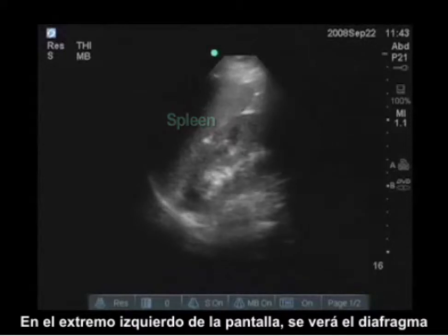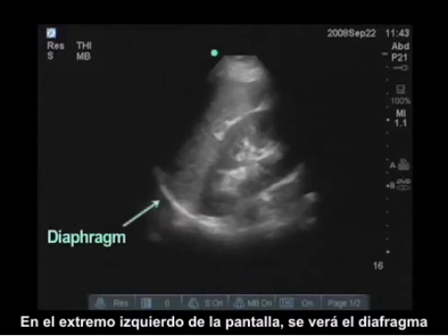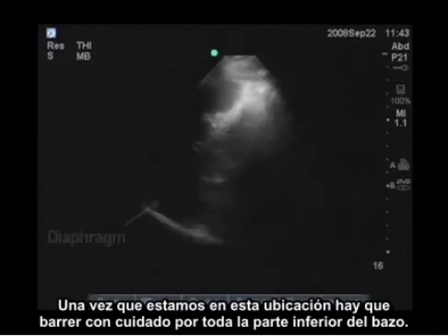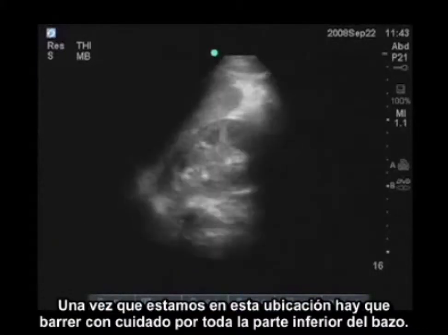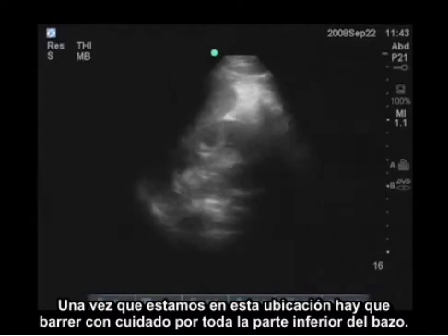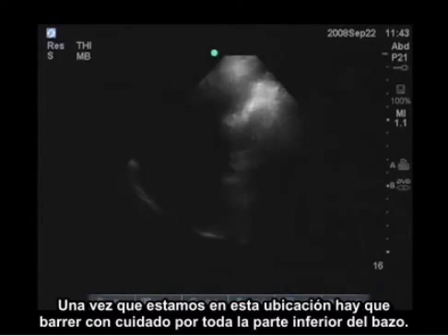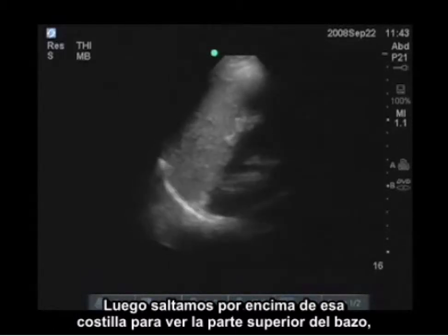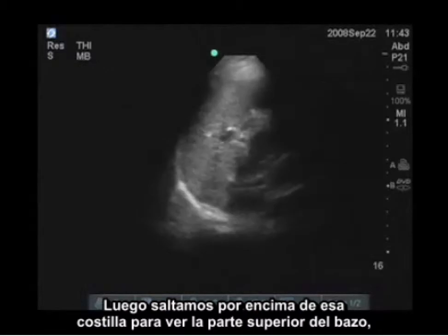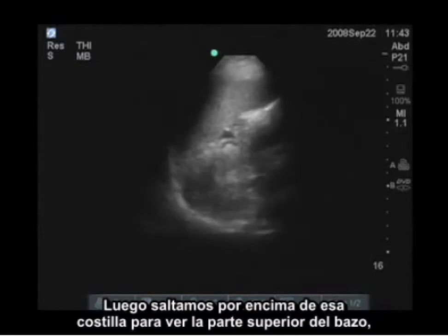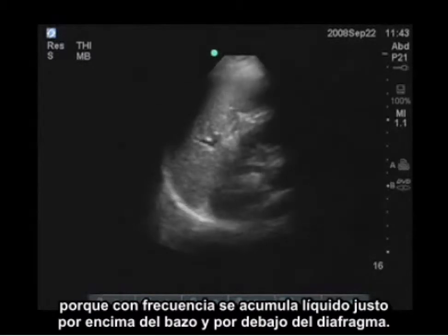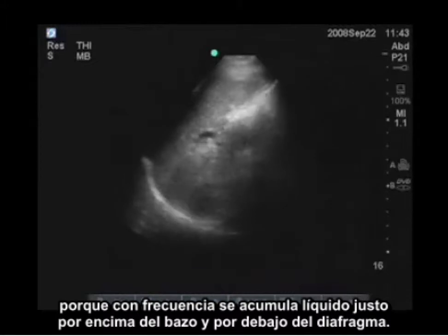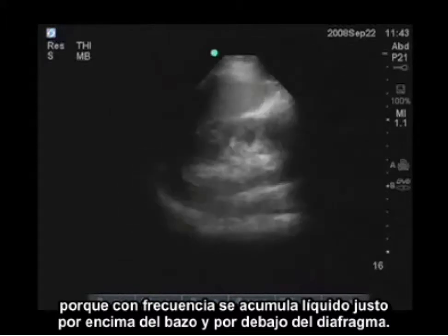To the far left of the screen we also see the diaphragm. Once you're in this location, you want to carefully pan through the inferior part of the spleen and then jump over that rib to see the superior part of the spleen, because fluid often collects just above the spleen and below the diaphragm.